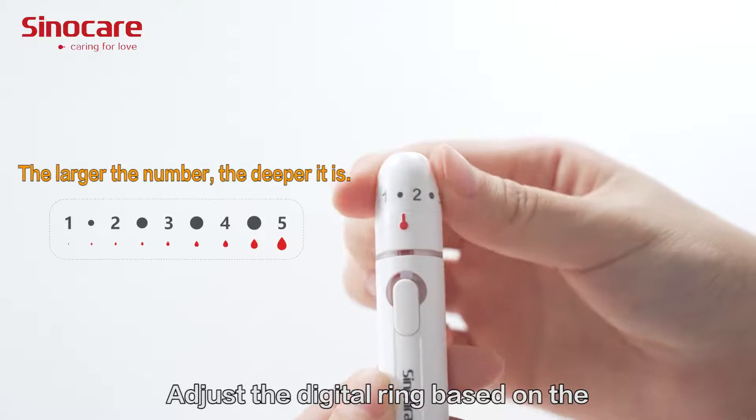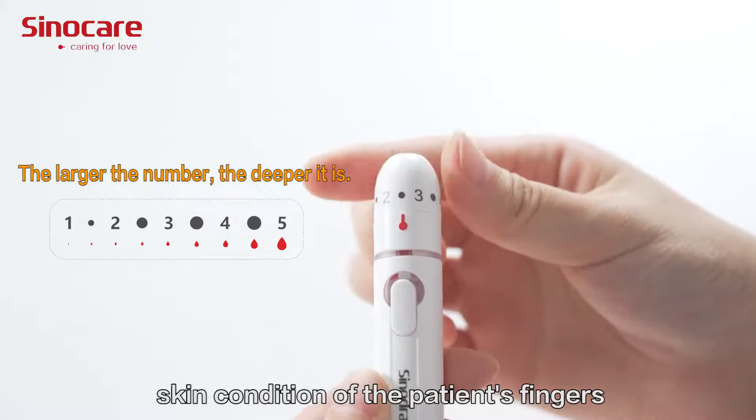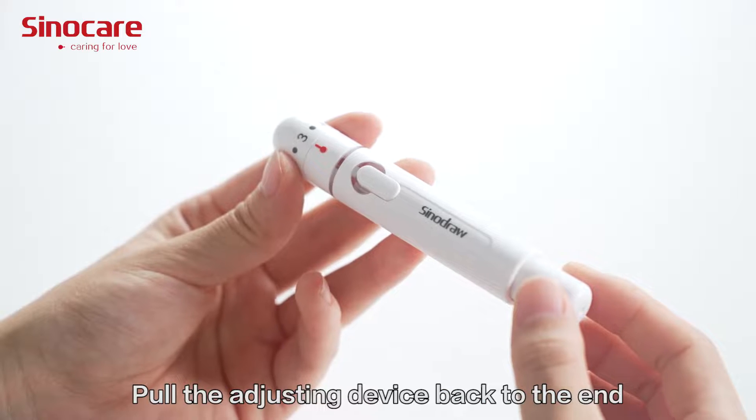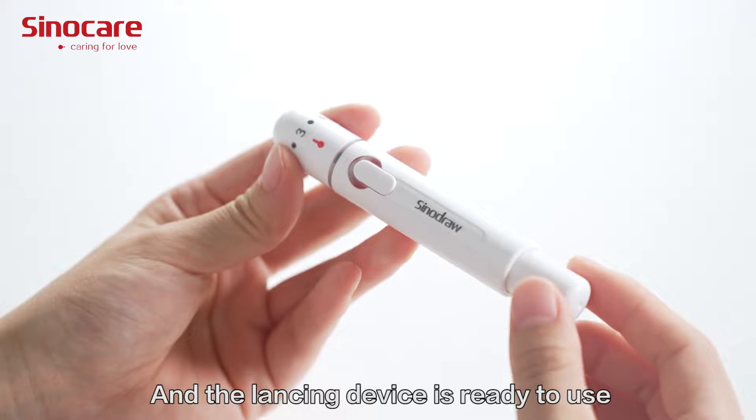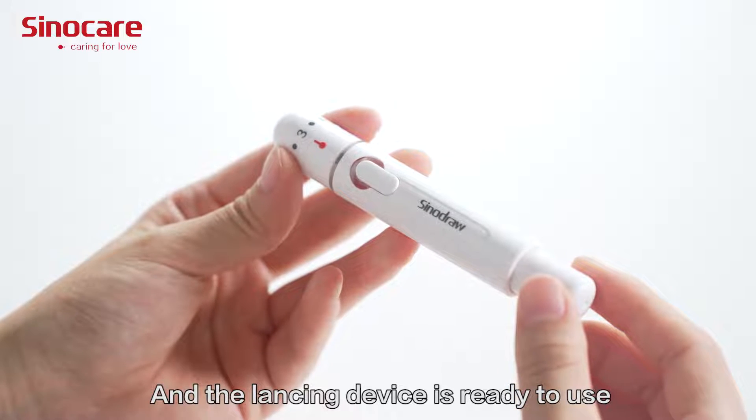Adjust the digital ring based on the skin condition of the patient's fingers. Put the adjusting device back to the end. It will spring back automatically, and the lancing device is ready to use.